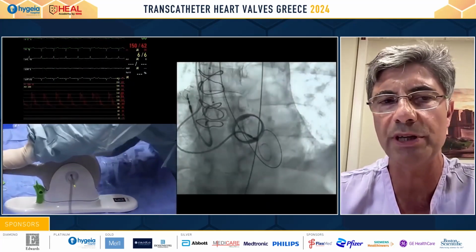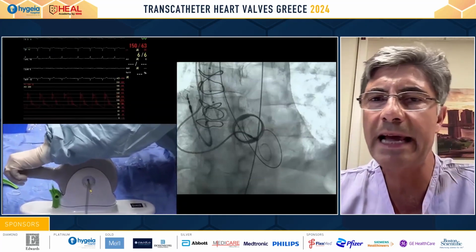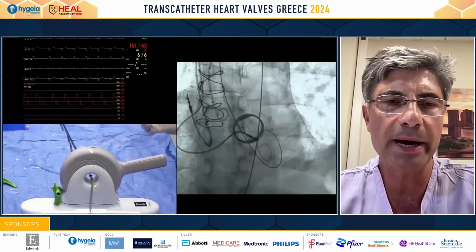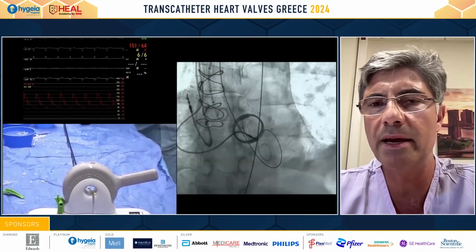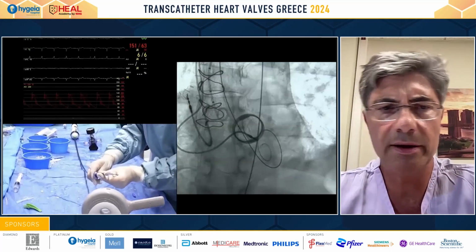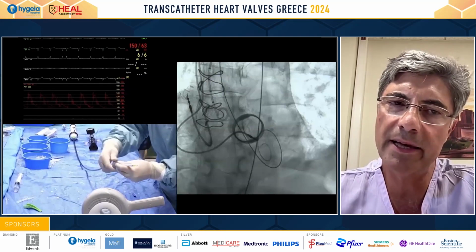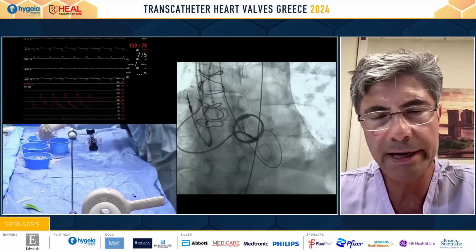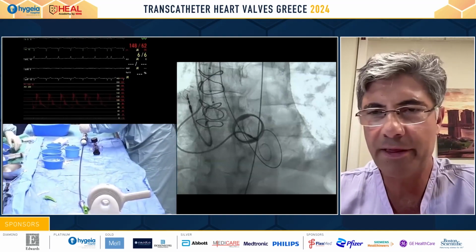Especially, I think this is the LAO view Dr. Kilic mentioned before. Yes, yes. And I think in this situation, when you need to be really accurate, pacing with the wire is even more important. When we changed our practice and started pacing with the wire, there were many advantages, not only patient-wise but also economic. We managed to decrease our length of stay by 2.5 days by incorporating the benchmark protocol, which is very nice, and I suggest everyone do it.